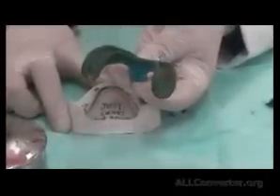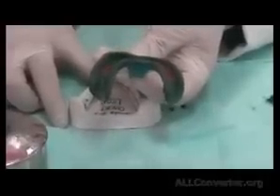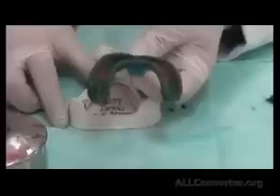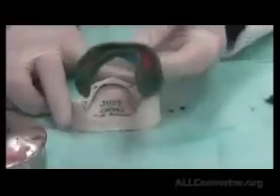And now we are ready to take secondary impressions. This will be the work for today. Those that have a lower impression are going to border mold the lower. Those of you that have an upper impression, they're going to border mold the upper tray. And then we're going to go to the next step, next lab, where we're going to take impressions and do the boxing. Thank you.